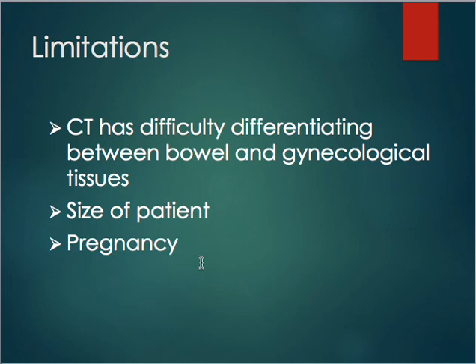Remember before, the opening inside of a CT scanner is only so big. So if someone is very large or overweight, we might not be able to get them to fit through the opening. And also, our tables do have weight limits. So if the patient exceeds the weight limit, we're not going to be able to put them on the table either because it can damage our equipment.